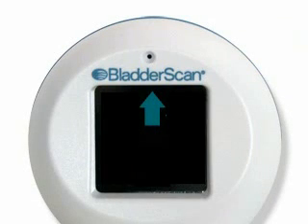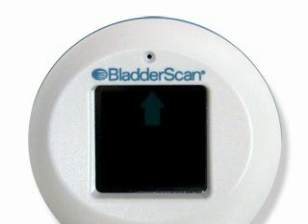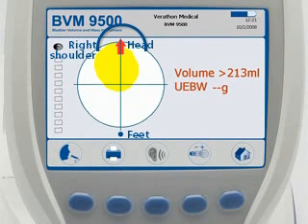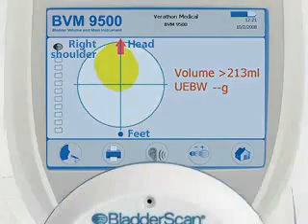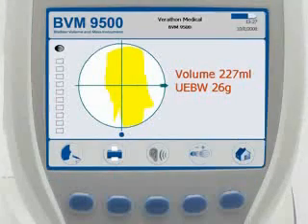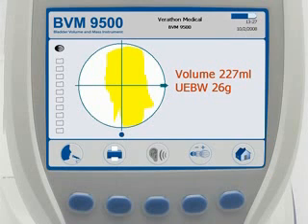If the scan is off target, the probe will show an arrow indicating the direction to move the probe to be on target. If the arrow on the probe screen is flashing, you are significantly off target and must re-aim and re-scan. The console screen will show a red arrow indicating the direction to re-aim. If the arrow on the probe screen is solid, you are slightly off target and must re-aim and re-scan. The console screen will show a green arrow indicating the direction to re-aim.